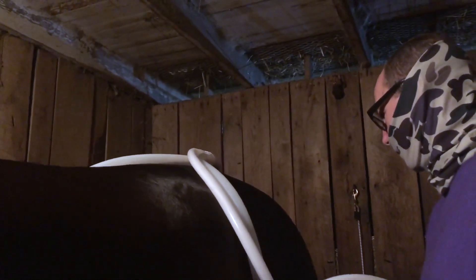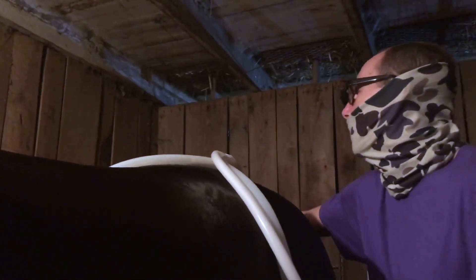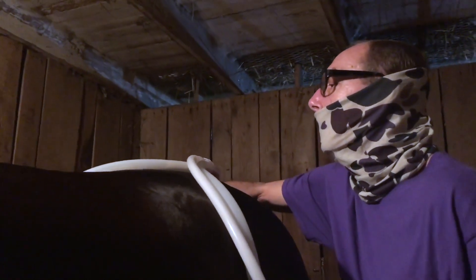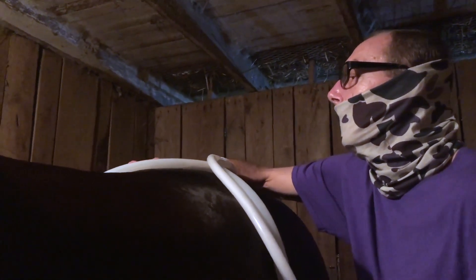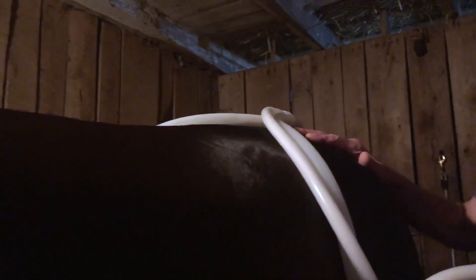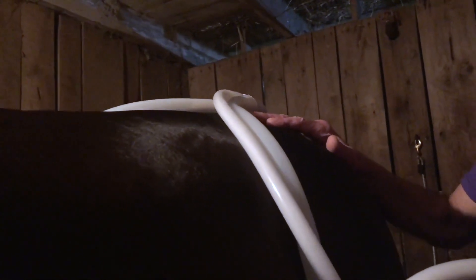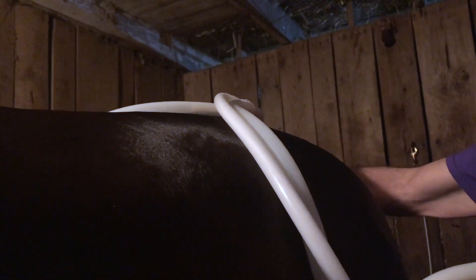Do you focus more on the full body or specific areas? You start with a lot of focus on the rear end — the engine for a horse. Every horse is different. Rob will start off with a smaller loop or paddle just to kind of go over them to see where they might be checking, and then take it on a horse-by-horse basis.